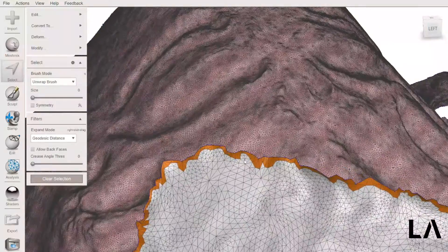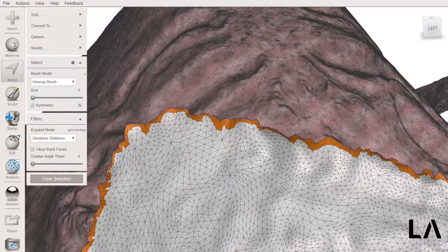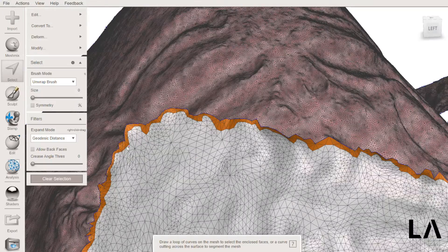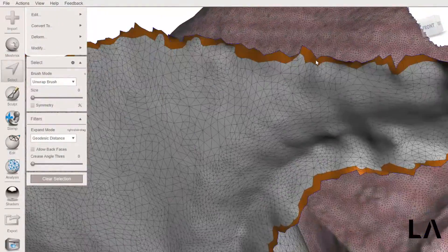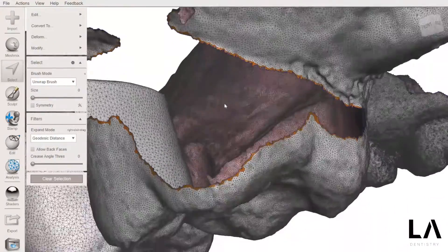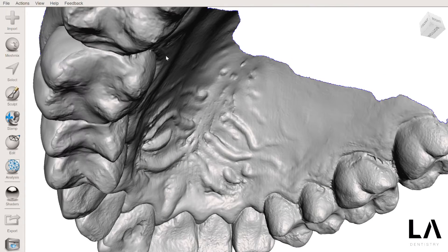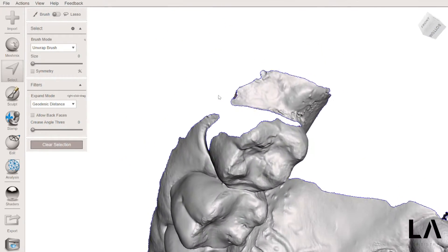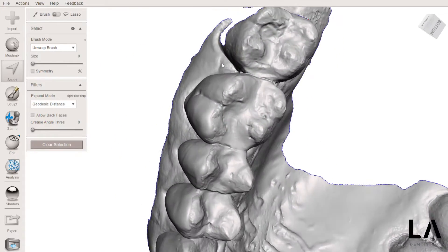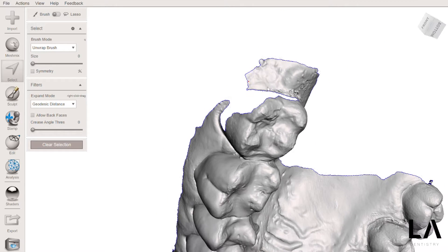Now every triangle in the border is selected and I'm going to use a shortcut — press the letters O, B, A. Unfortunately there is something going on in the mesh that does not allow me to properly see and smooth the boundaries. So I will clear the selection and press the letter S to select, and try to properly repair the mesh.